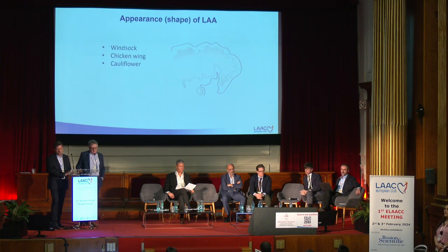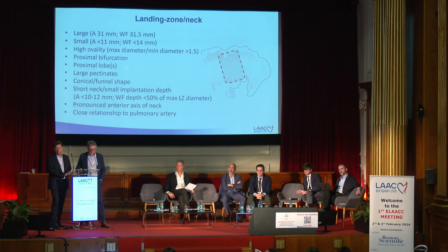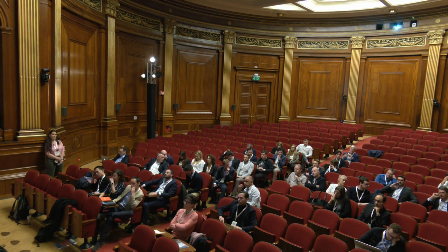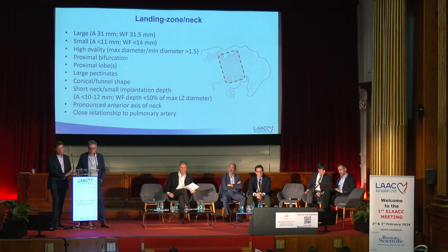Just a quick comment on the previous slide. You say that we have to analyze the relationship between the landing zone and the pulmonary artery, which is sound. I think we should also consider analyzing the relationship between the landing zone and the circumflex artery. I think if the distance is too short, there might be a risk of compression. Yeah, at least in my experience.